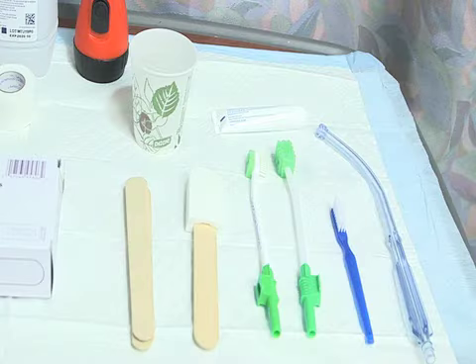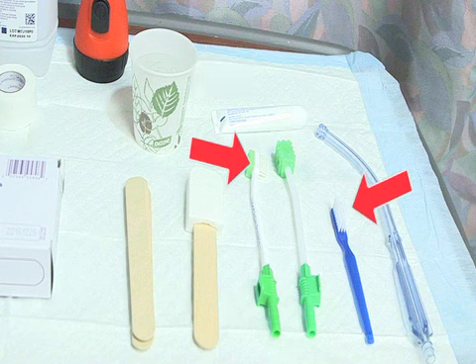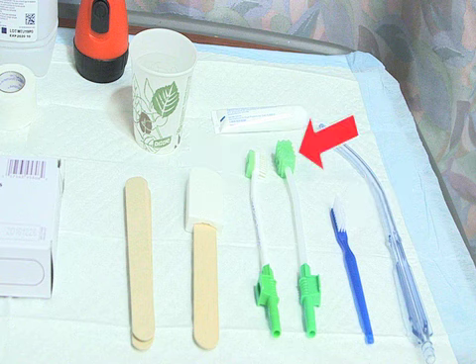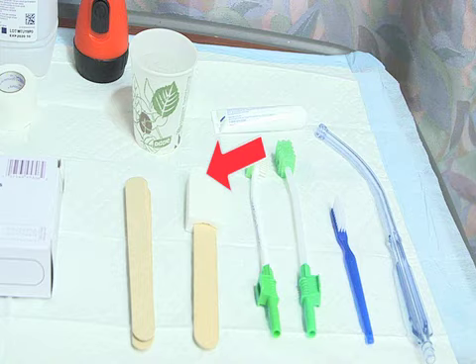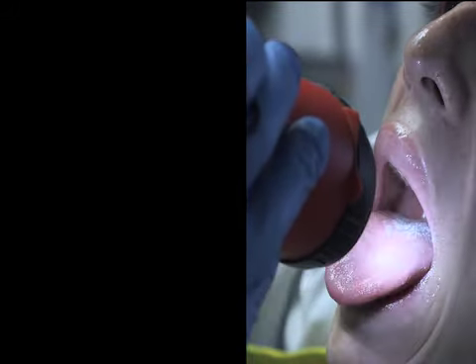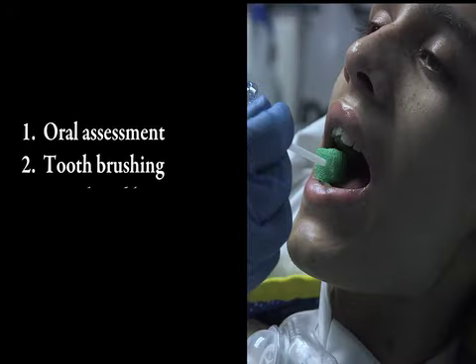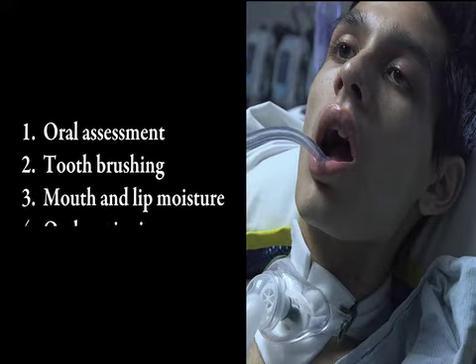To perform comprehensive oral care, you will need the following: a cup of sterile water, water-based lip and mouth lubricant, a soft bristled toothbrush, sponge-tipped toothettes, and a suction device. You may also require a disposable mouth prop. The 4 components of comprehensive oral care are oral assessment, toothbrushing, application of mouth and lip moisture, and oral suctioning to remove excess secretions and debris.